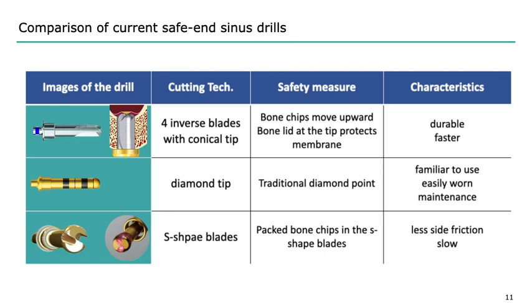So the pressure that you can feel from this kind of transcrestal approach using the third one is usually from the floor. But these characteristics are based on my personal preference, so just take this as my personal preference, okay.